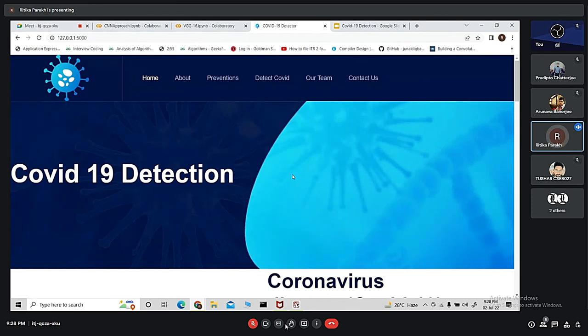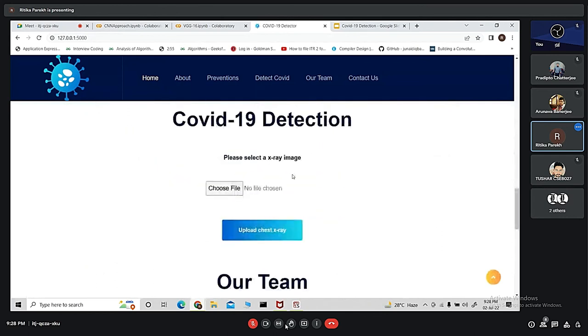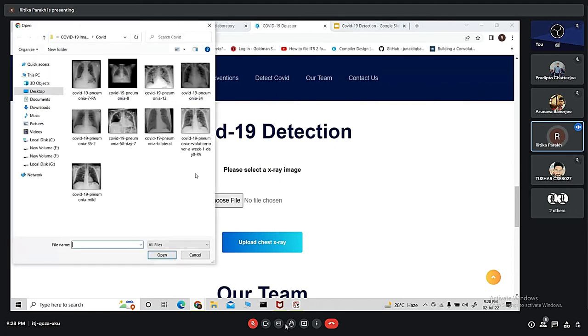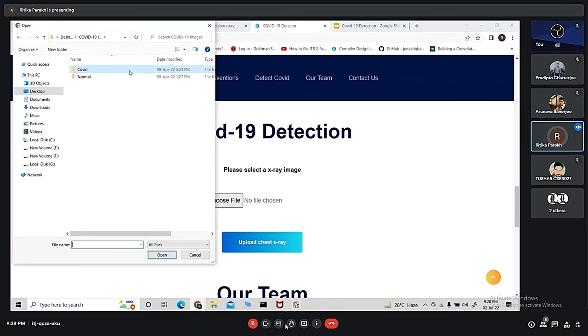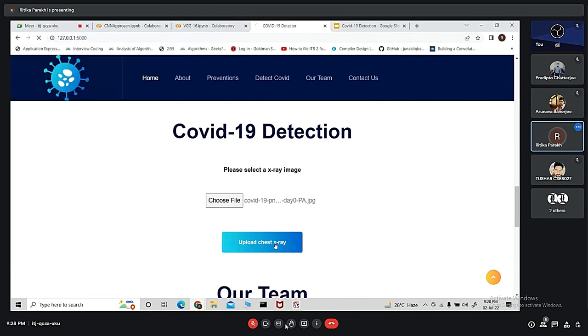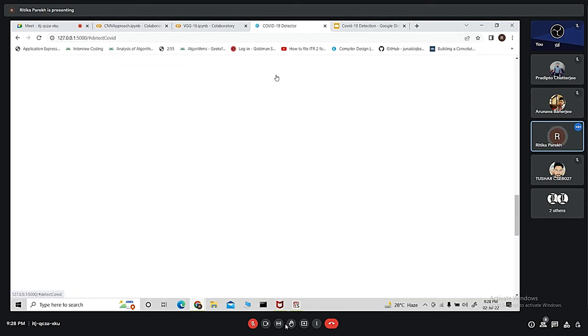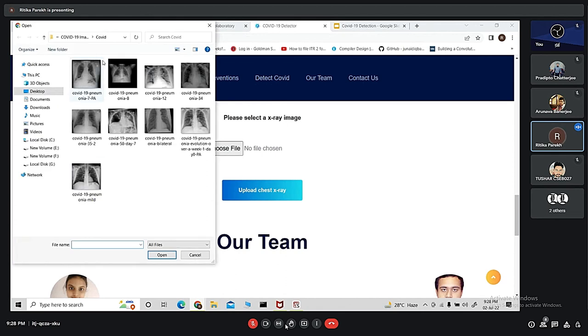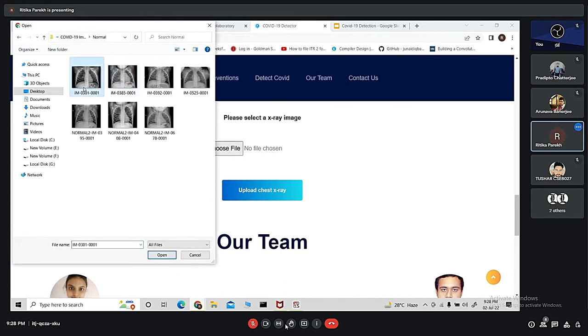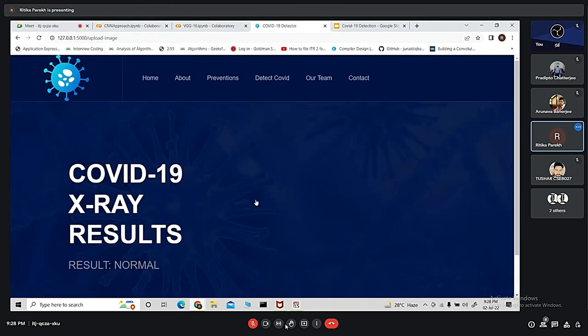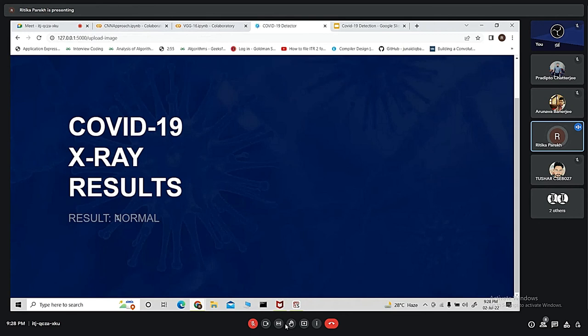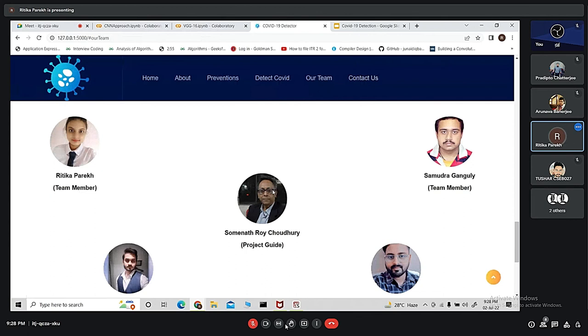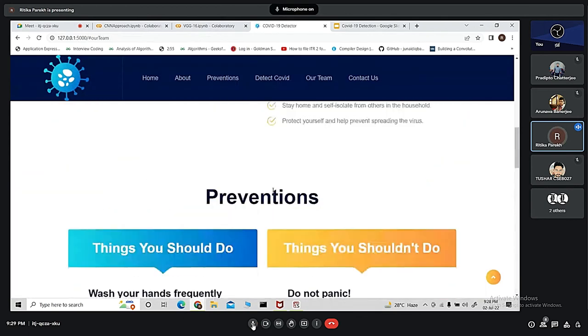This is our landing page. And this is the main working of our application. From here, we have to choose a file. I've already created two folders, COVID and normal. Suppose we are choosing any image from COVID folder and uploading it, it will show the result that it's COVID positive. Again, if we choose a file from normal, we upload it and get the result as normal. These are our team members.